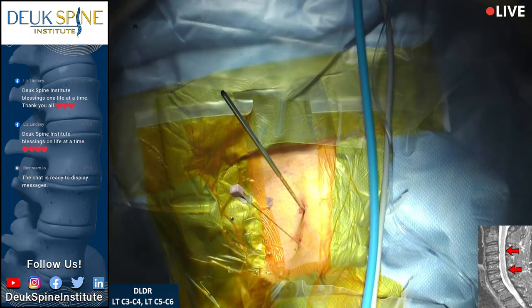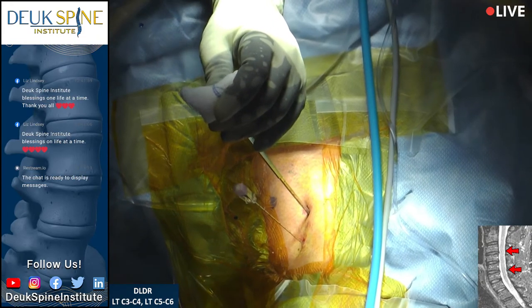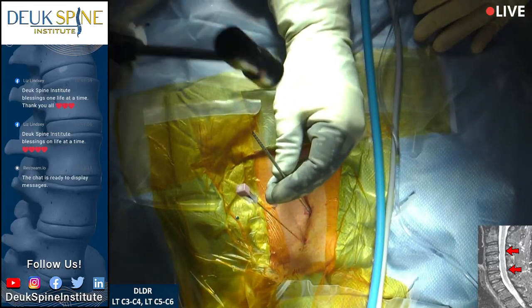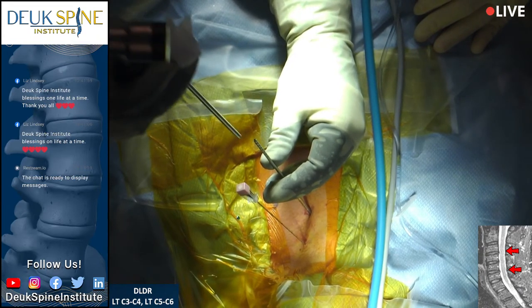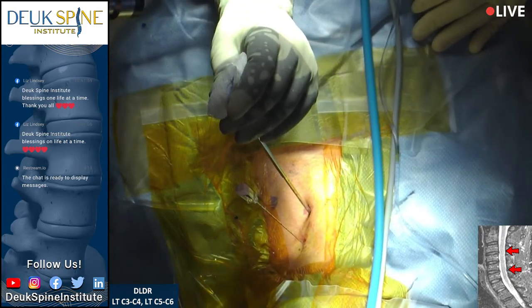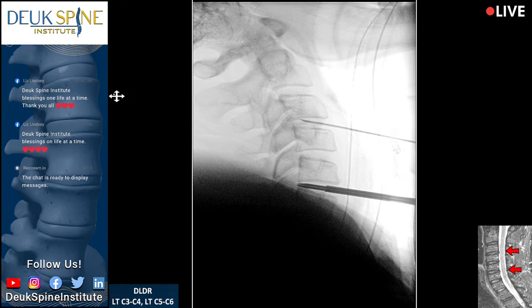This patient has had this tear for years, as many people do. Unfortunately, through the tear, the herniations have pushed out and will continue to push out until we fix the tear. The disc is under a lot of pressure — it's pushing my dilator out. That's from inflammation; that's what the tear does — it causes inflammation.